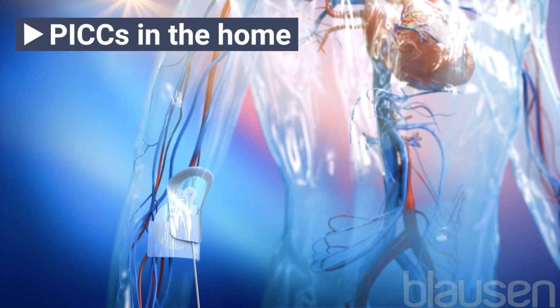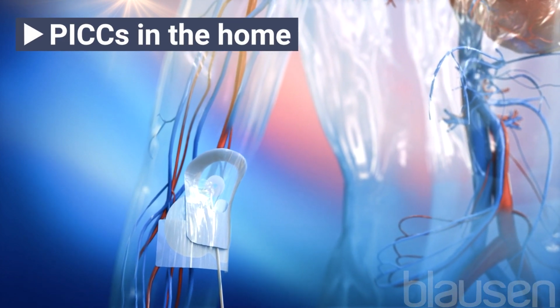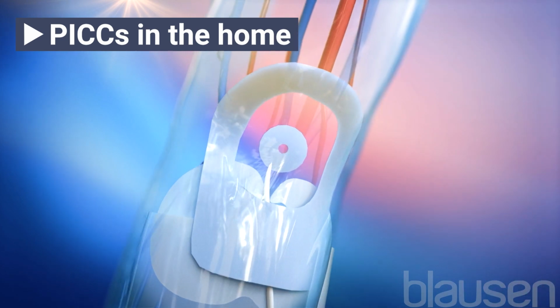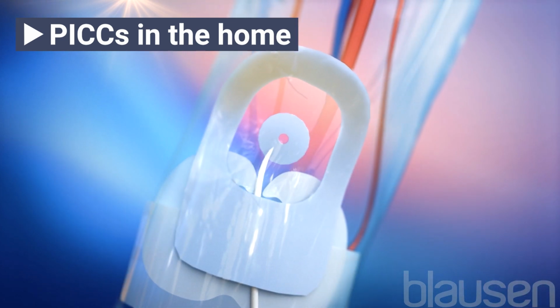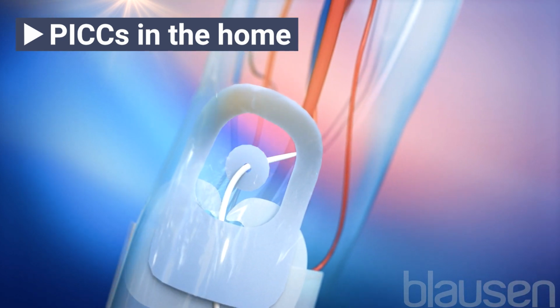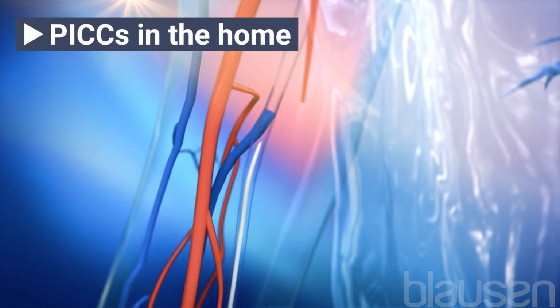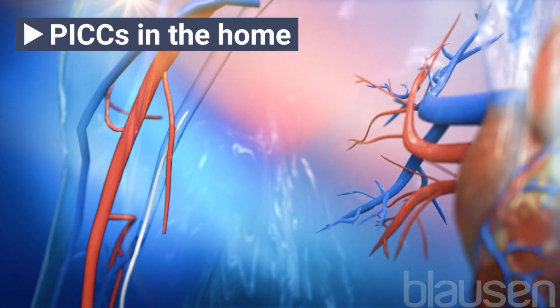Some patients may have a PICC in the home. PICC stands for peripherally inserted central catheter. PICCs enter into one of the veins in the upper arm. PICCs then travel through the veins up the arm and into one of the major blood vessels just above the heart. For this reason, PICCs are considered central lines.